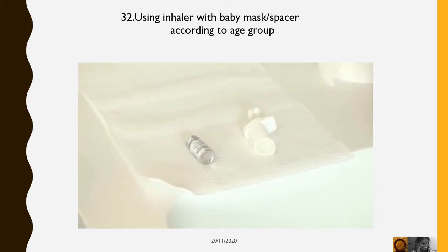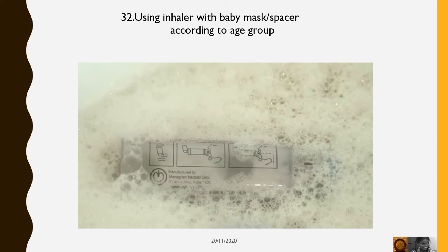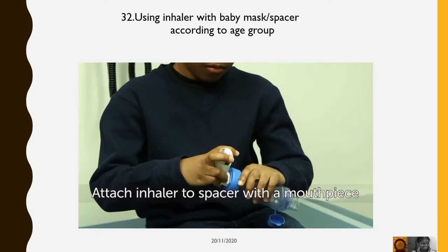Clean the spacer and mask each week by soaking in warm soapy water for 15 minutes and run water through it. Shake off water and set overnight to dry.